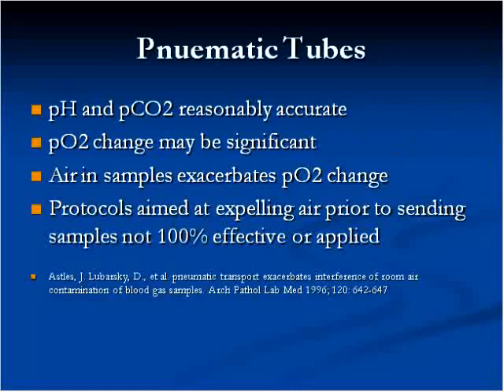Just a quick comment, again, about practice with pneumatic tubes. My research here was I found that pH and PCO2 were reasonably accurate whether you tube the blood gas or not. PO2 changes, however, could be significant, and especially it depended on if you had air in the sample. And protocols aimed at expelling air prior to sending samples were not 100% effective or applied.